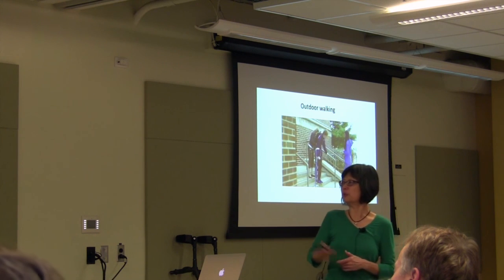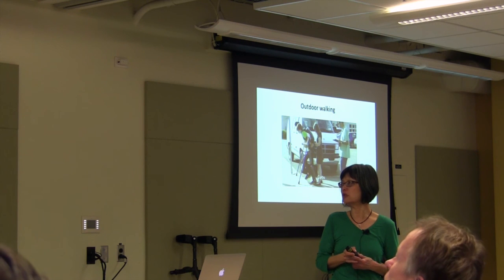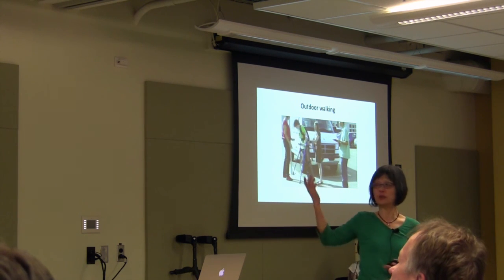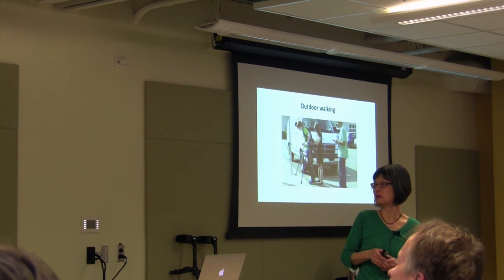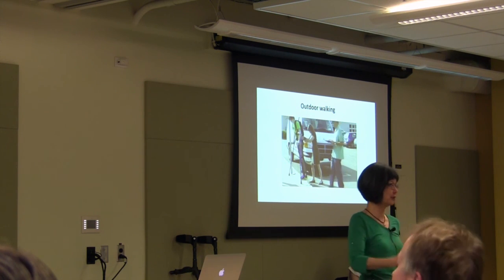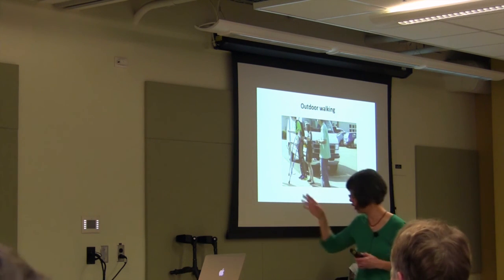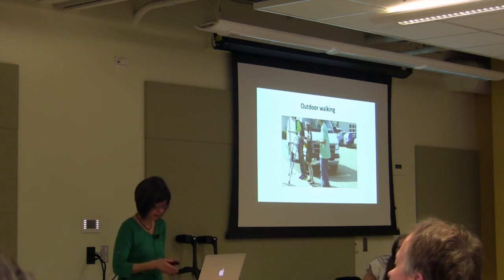And then, of course, you would want to be able to walk up curbs, and so here she's trying to go up a curb, and you can see her toe catches. So it was important to have the therapist there. And then she tries again. And this time it doesn't catch, but she can't quite pull herself up onto the curb. So there are lots of little issues, and it's not easy for these kinds of higher level walking skills.